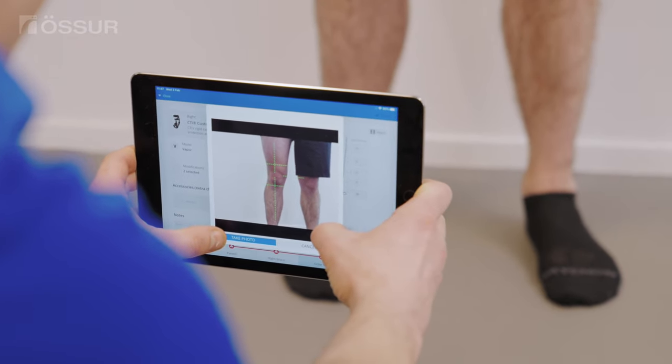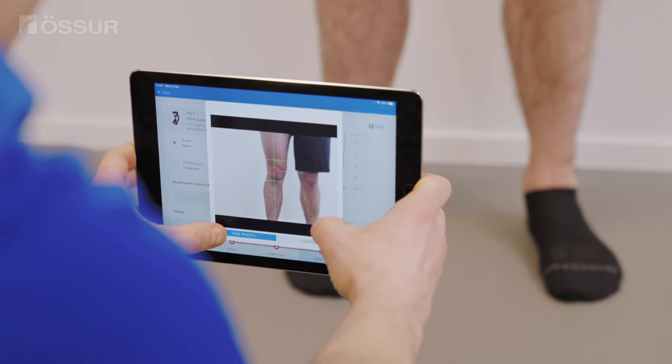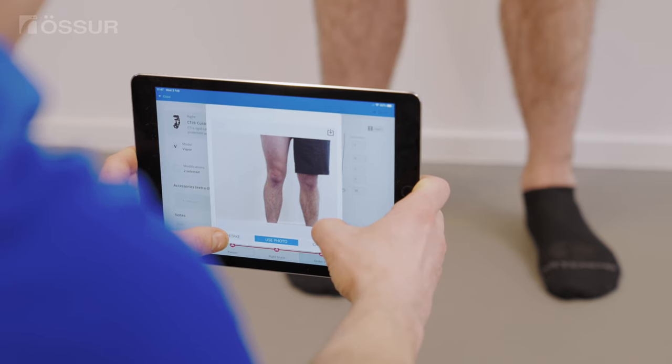Align the grid to capture approximately 10 inches above and below mid-patella. Ensure the camera is held at the level of the patella. Tilt the camera until the grid turns green, which means the camera is level and ready to take the pictures.